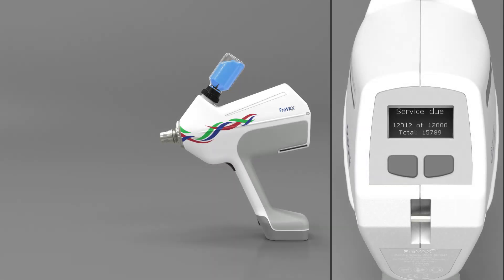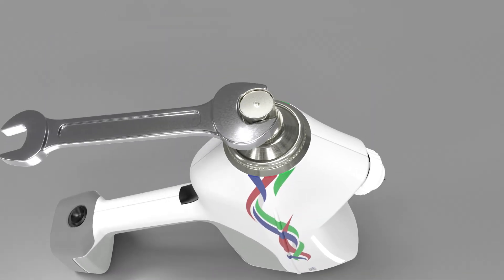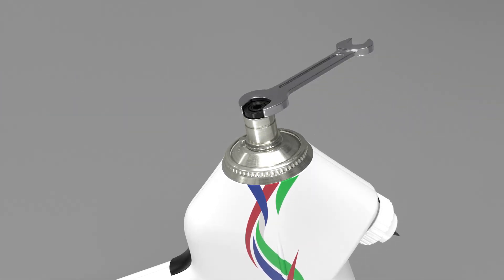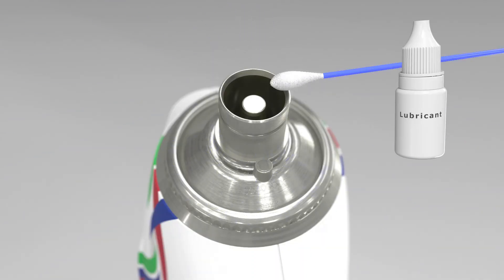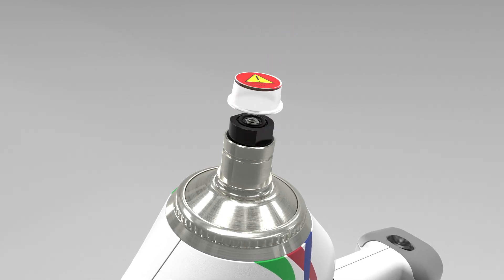After cleaning, allow the Freevax and its battery to dry completely before storing. Service of the Freevax is required after every 12,000 injections. When service is due, the message 'Service Due' will appear on the display. All wear and tear parts are combined in one unit — the cylinder. The only necessary service step is to replace the old cylinder with a new spare cylinder using common tools. This can easily be done at the farm within one to two minutes. For further details, please check our separate video about the cylinder service.